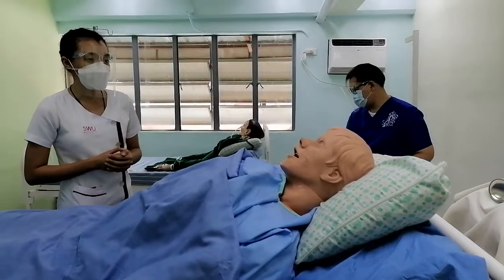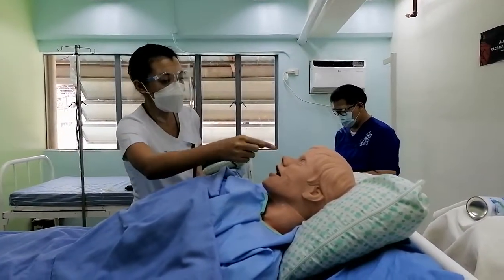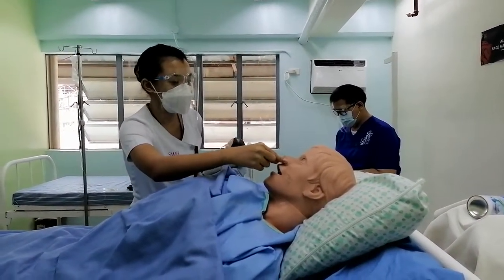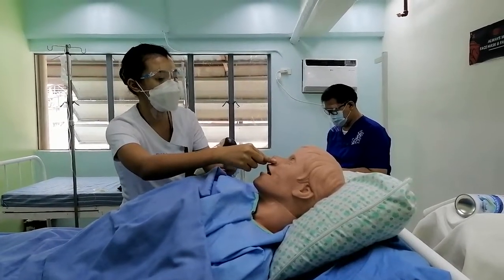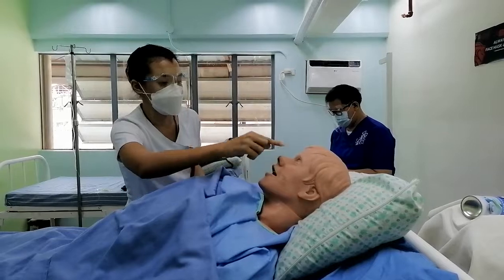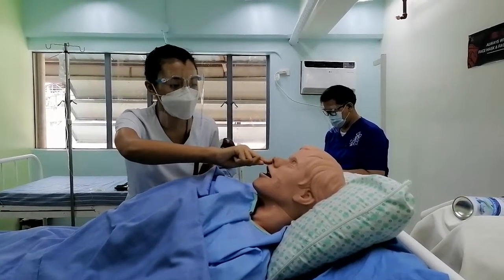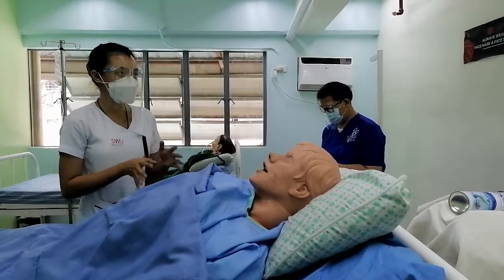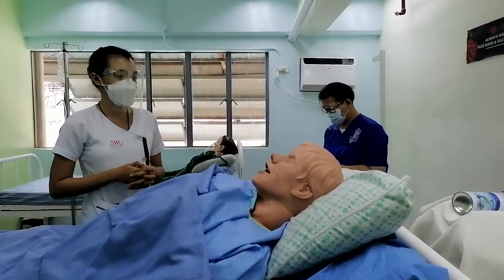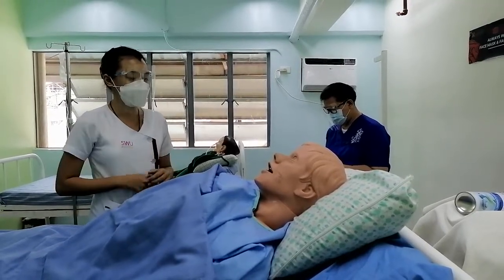In order to assess this, we will occlude one nostril with our hand and then determine the intensity of the air being expelled from the other nostril and compare it to the other nostril. Breathe in, sir, and out. The purpose of doing that is that we will be able to determine which nostril is a good candidate for insertion of the NGT.